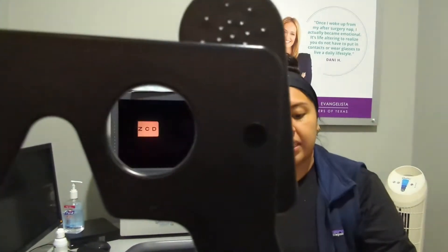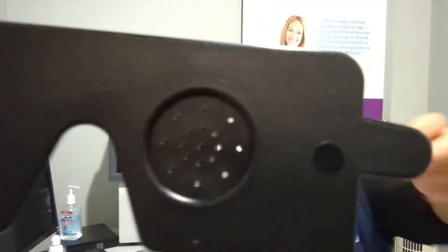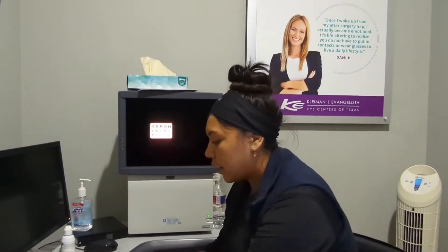I want you to go ahead and hold this. Can you see any of these letters here? Good. And what about now — I'm going to go ahead and switch this over. Can you see this set of letters right here? Okay, so we've checked your vision and now we're going to go ahead and check your eye pressure.